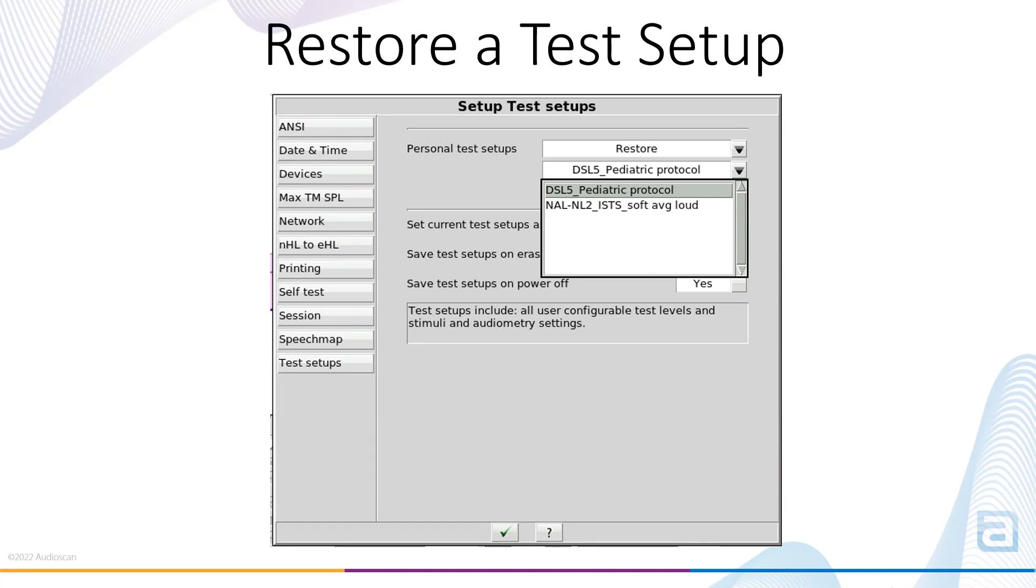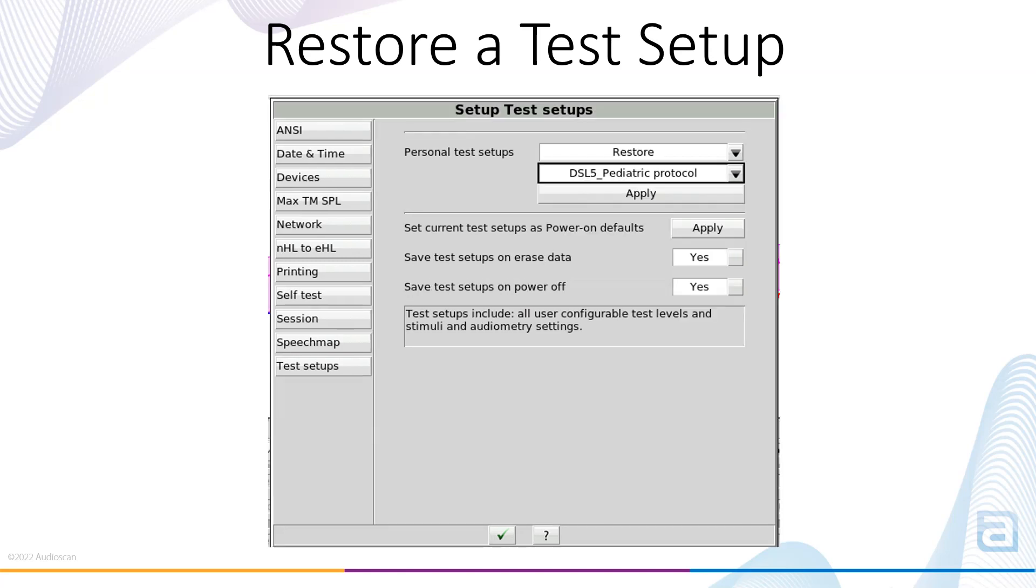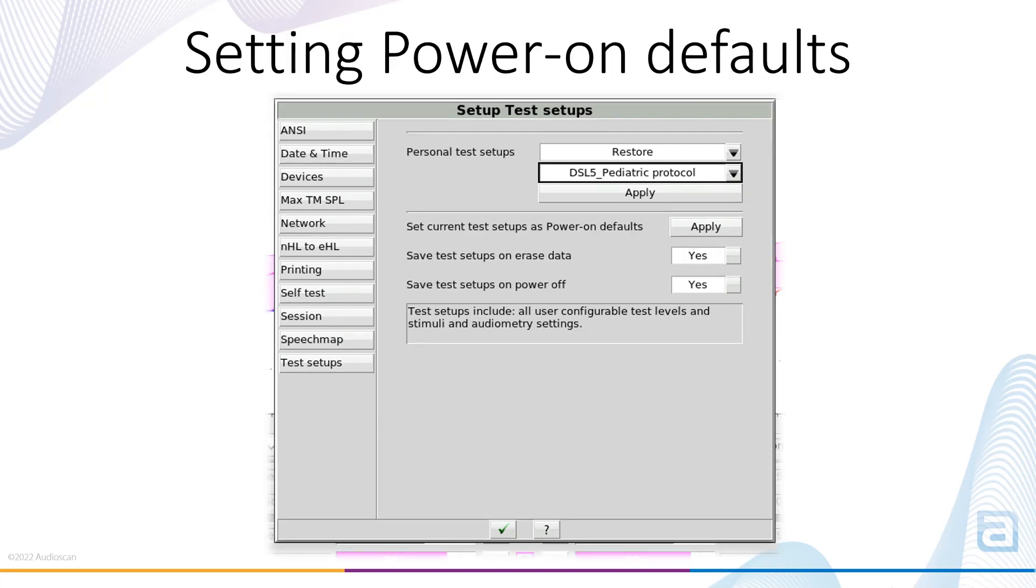Once you have stored a Test Setup and you would like to recall it, select Restore. Choose the desired protocol from the drop-down menu, and then select Apply. If there's a protocol you use most frequently, you can set the Test Setup as your Power On default for the system. To do so, restore the protocol, and then select Apply beside Set Current Test Setups as Power On Defaults.